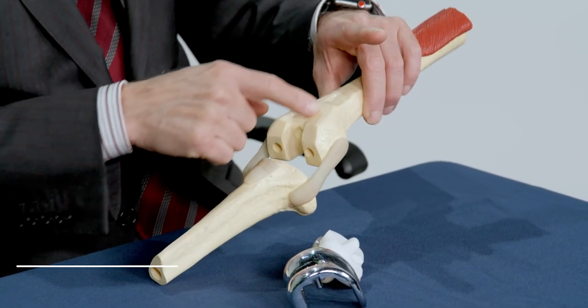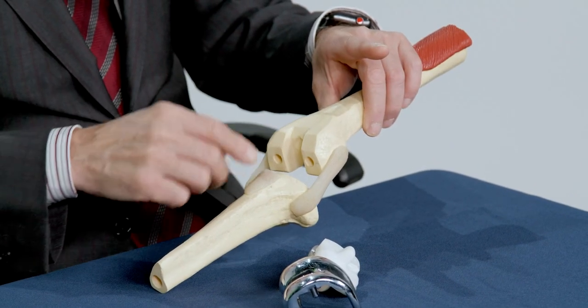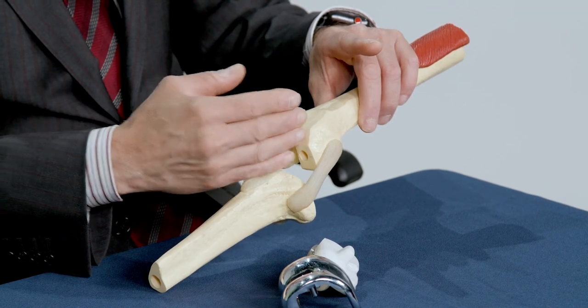Knee replacement surgery is performed when all other options for managing a painful arthritic knee have been exhausted. During total knee replacement surgery, a cut is made over the middle of the knee joint and the kneecap, which is not here, is shifted to the side.